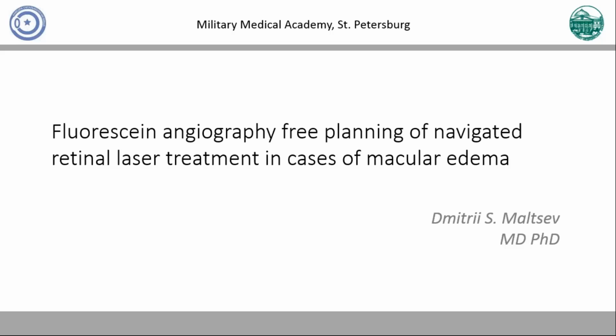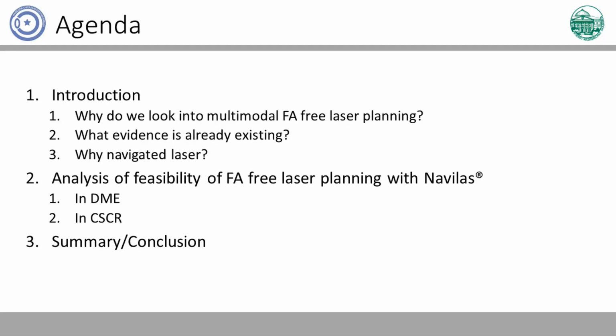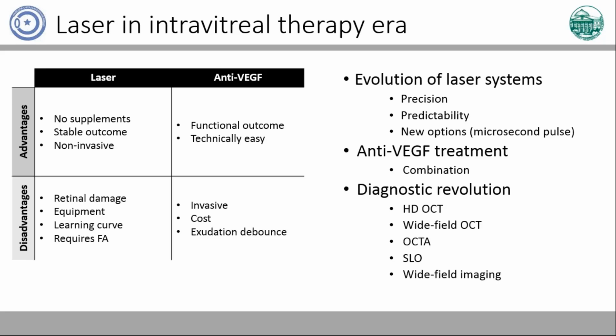Hi, everybody. It's a pleasure to be here. Thanks to the organizer for this kind invitation. Today, we're going to talk about a fluorescein angiography-free approach for navigated laser planning in different disorders. Here's our agenda. Specifically, today, we're going to talk about treatment of diabetic macular edema and central serous chorioretinopathy, including acute and chronic cases. And we will start with an introduction.